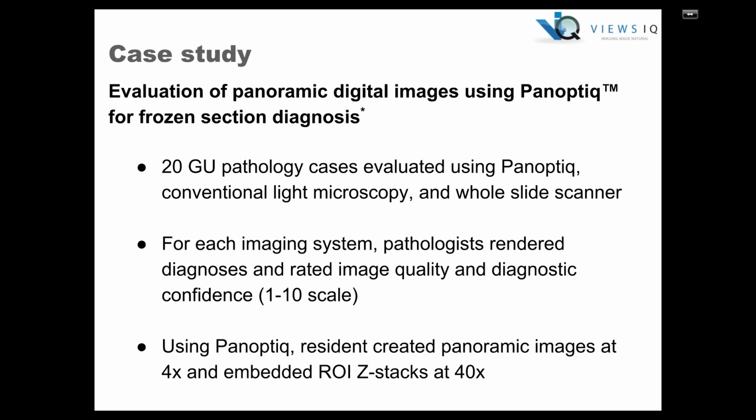Using the Panoptic system, a resident created panoramic images of the entire slides at 4x, and they embedded region of interest Z-stacks at 40x at representative regions of interest. And this workflow was designed to mirror that of ordinary microscopy, where a pathologist or a tech would typically review a slide at low power and periodically switch up to a higher objective to investigate potential abnormalities.